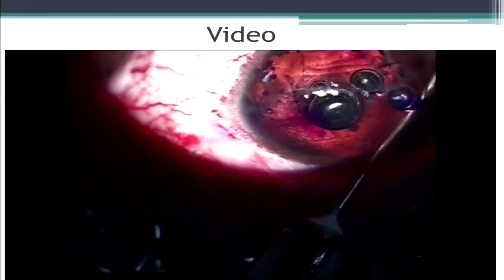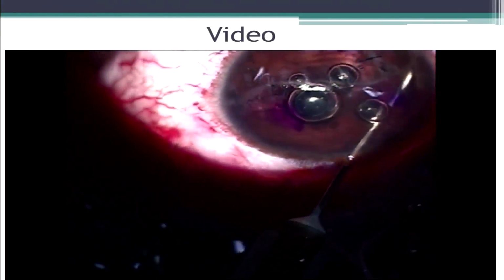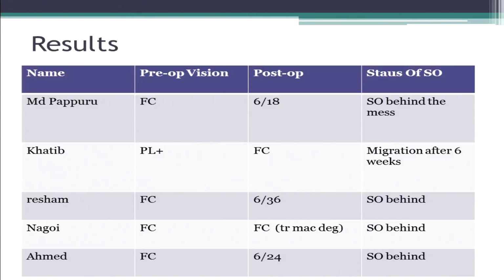A fluid air exchange is done and silicone oil is injected. Peripheral laser is done, and then we push the silicone oil behind the Prolene mesh with a viscoelastic. These are our 5 patients.